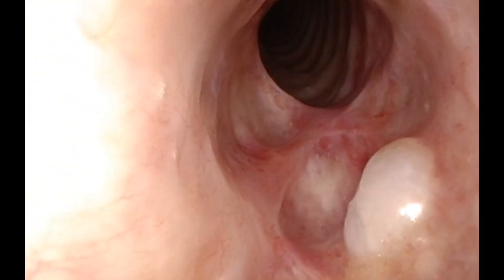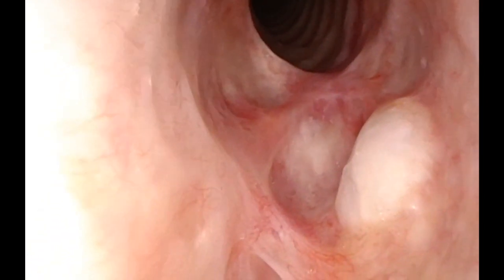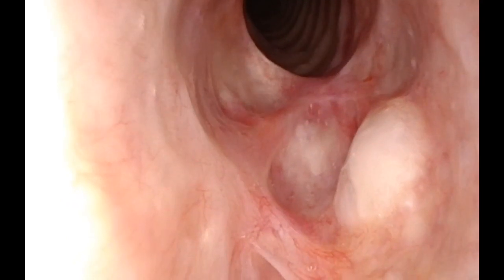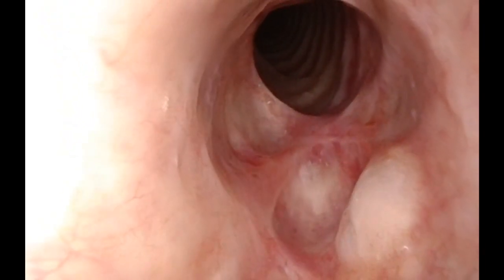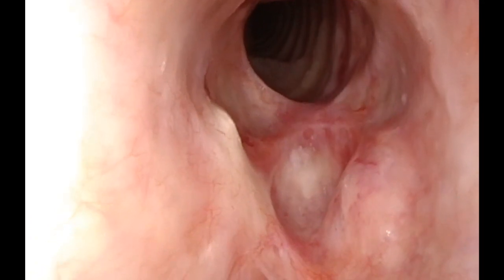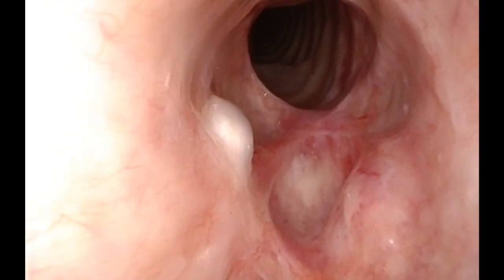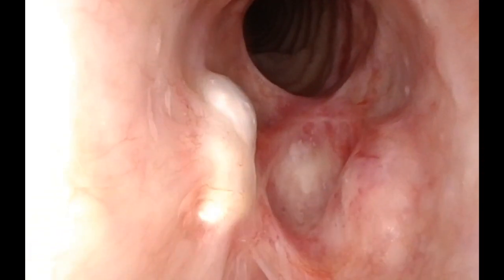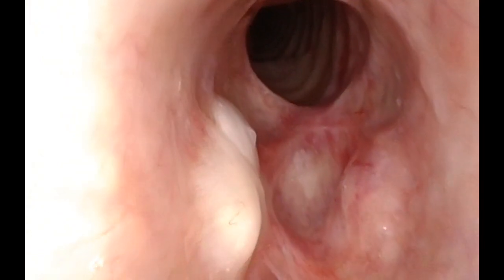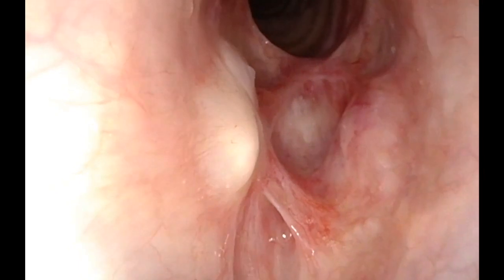During the procedure I'm using a very thin needle through the neck to perform the injection. I'm focusing on placing the needle tip very carefully directly under the mucous membrane, without entering the airway before injecting the steroids, to maximize the amount of steroids placed into the stenosis itself without leaking into the windpipe.